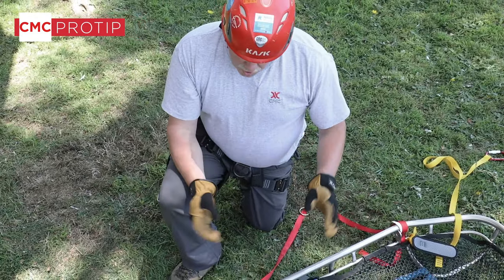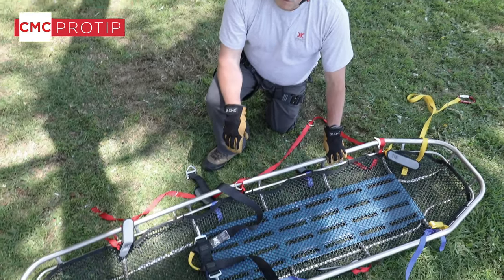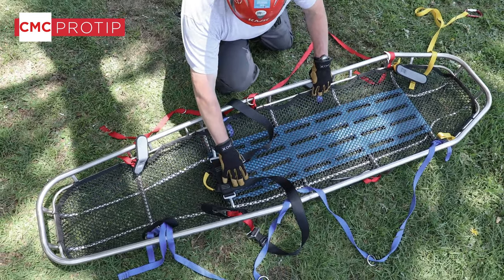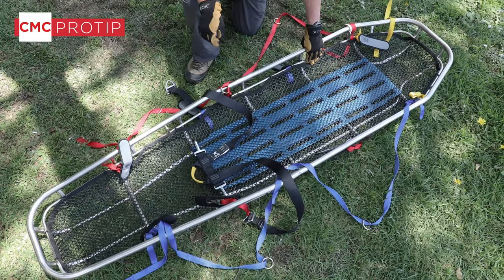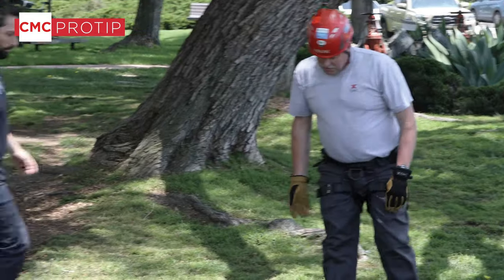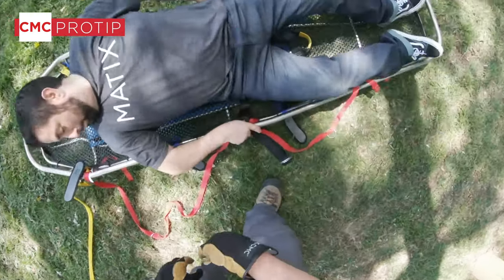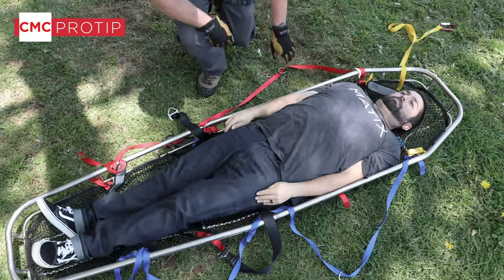We're going to continue on with actually placing the patient in the litter and utilizing the pelvic tie-in harness and the tie-in system. You'll see that we've pre-placed the pelvic harness in the basket so once the patient's in there it's much easier to put the leg straps on — we're not trying to fish that around. One of our CMC employees has volunteered to be our victim, so Kevin is getting in the Stokes basket.